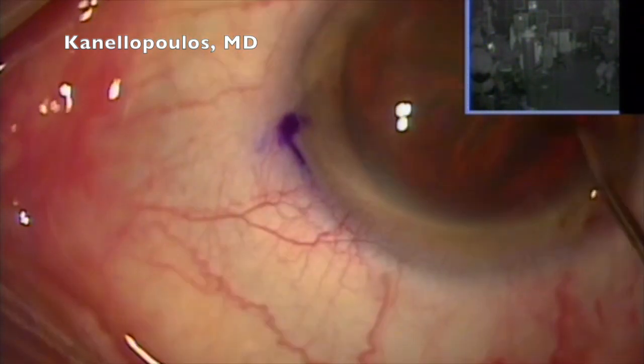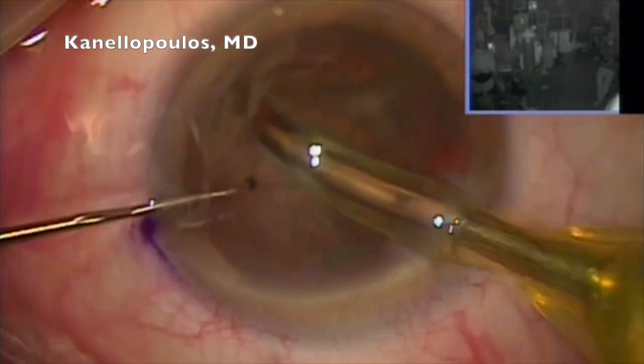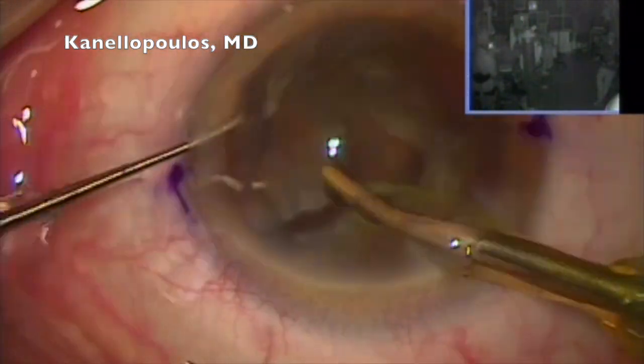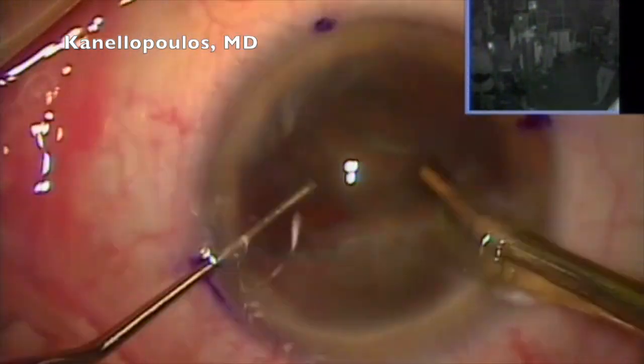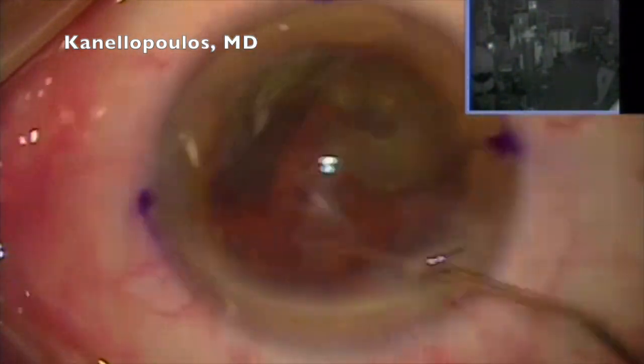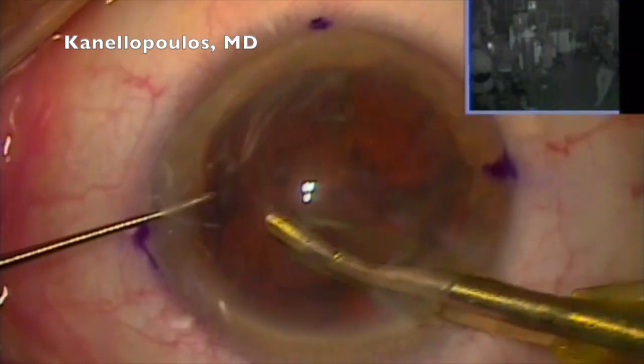I've commented on this before. We used a femto to do these rexes, but I have found that manually they're stronger, and we've shied away from using the femto. We had problems also using it after the peribulbar anesthesia. All these cases have peribulbar anesthesia here in Athens, Greece. We can't really do these procedures without.